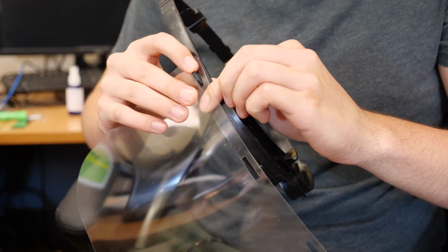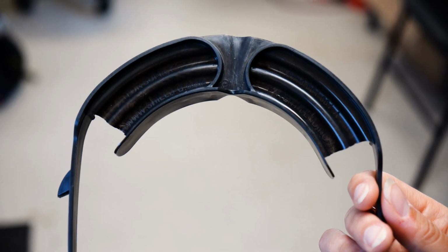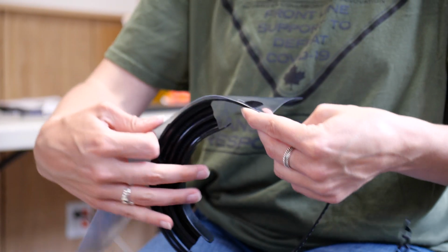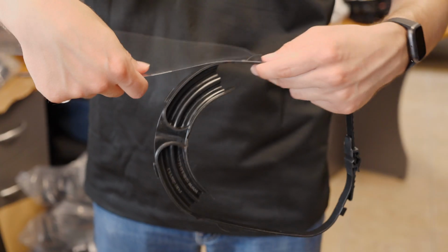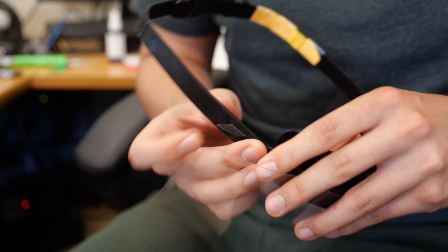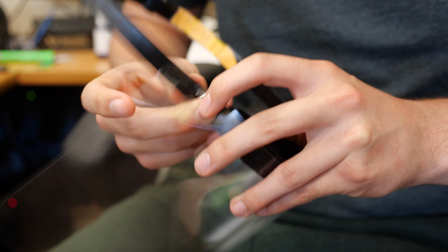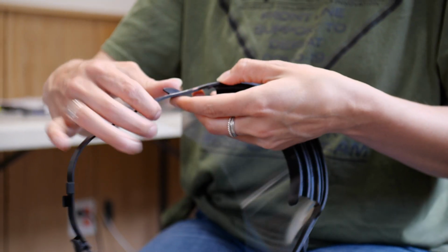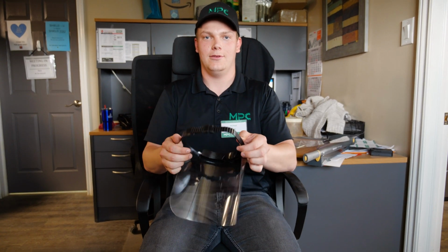The visor is universal and can be fitted left to right or right to left. Holding the headband with the text on the forehead baffle upward, place the first hole in the visor over the farthest retaining tab. Now, wrap the visor around the headband, locating the second and third holes over their respective tabs. When you reach the final retention tab, bend the headband strap forward, allowing the tab to fit into the final hole. Once engaged, the strap is returned to its normal position, creating tension in the visor to securely hold it in place.